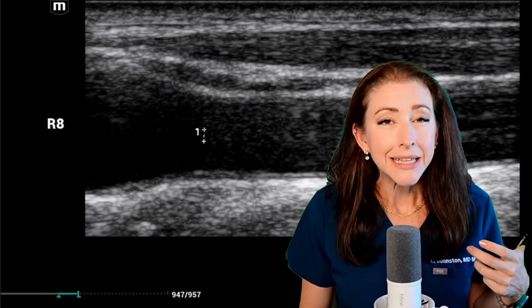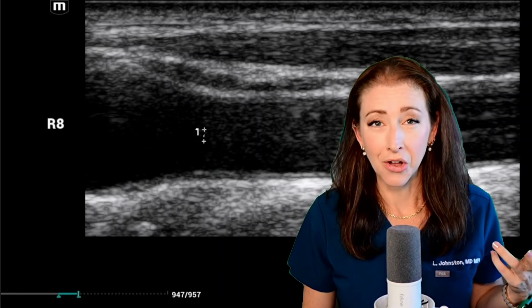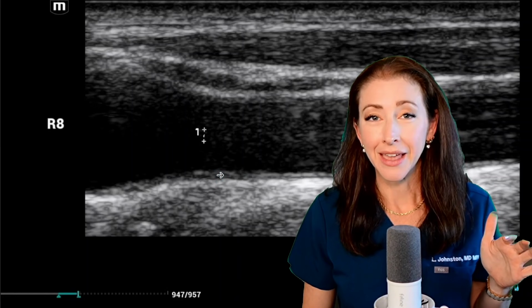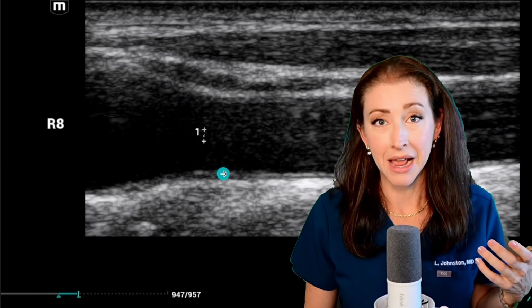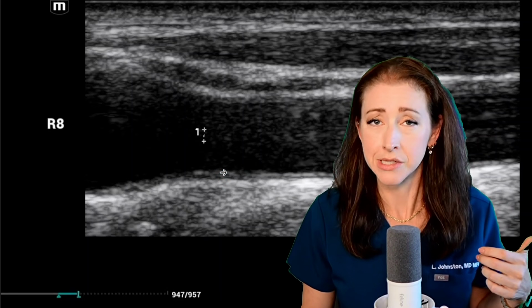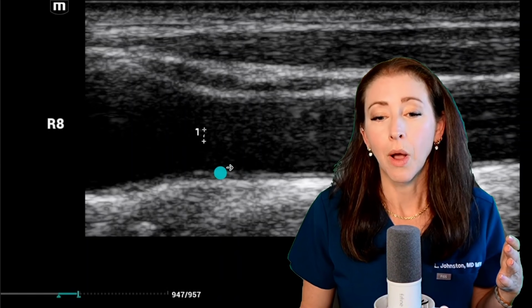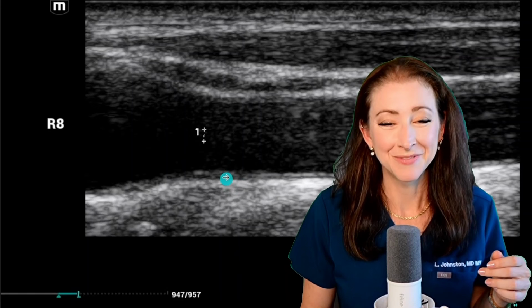When it's really, really badly abnormal, I can usually tell, and sometimes I'll make that call in the moment. But by and large, I will wait on the IMT measurement. And again, I wouldn't have been able to tell what my IMT had done from 2 years ago till now, or whether this looked thick or thin for my age, really. So, I'm not going to speculate here. I know what the report says, but we'll wait for that.